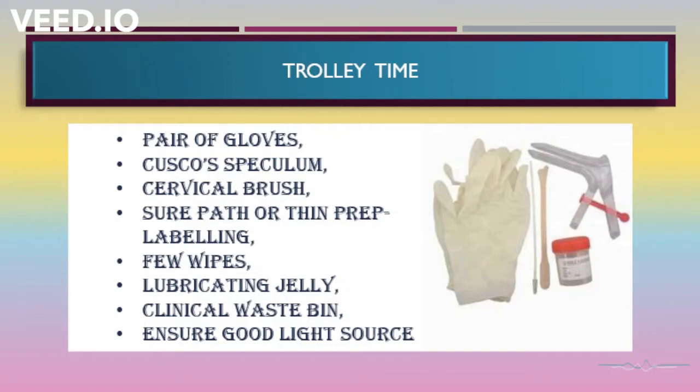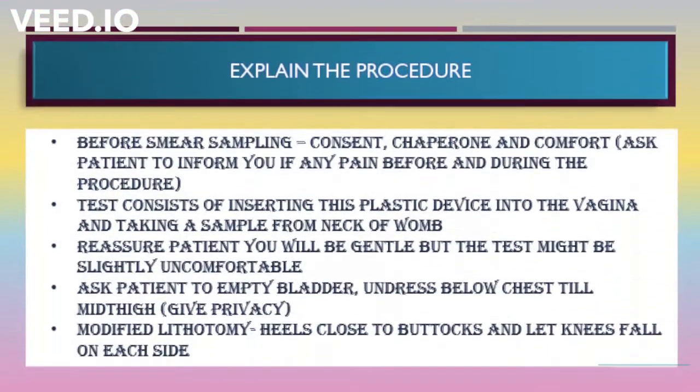And you would need to label it, so always keep a pencil or a pen with you. Few wipes, a lubricating jelly, and the clinical waste bin. Also, do not forget that you have to sanitize your hand prior to beginning the procedure, before wearing the gloves. So the trolley time can come after having explained the procedure to the patient.